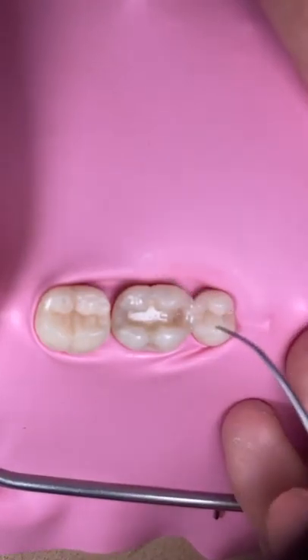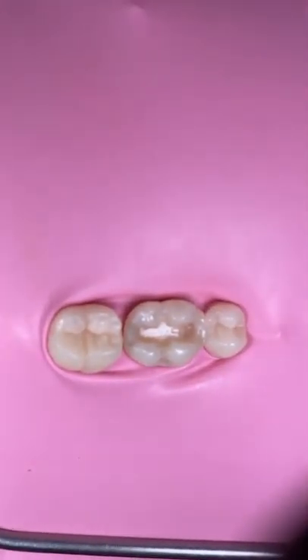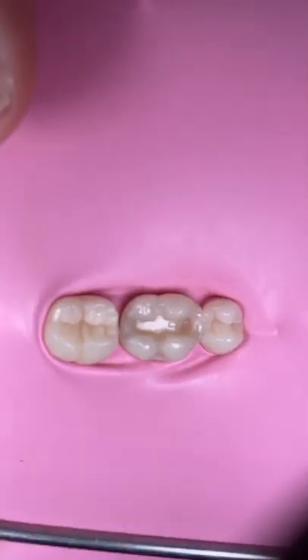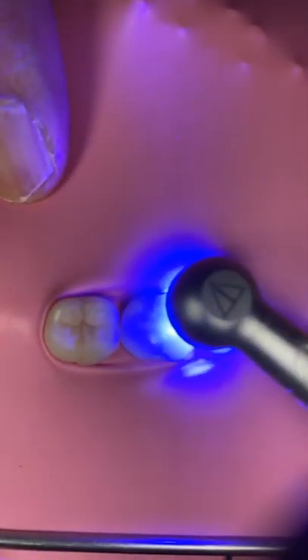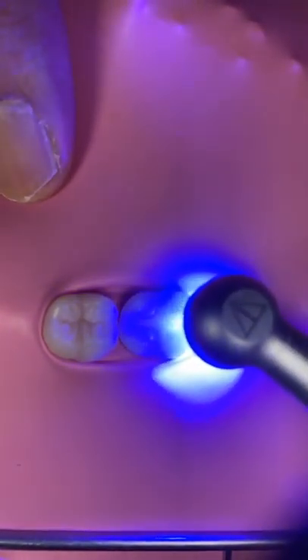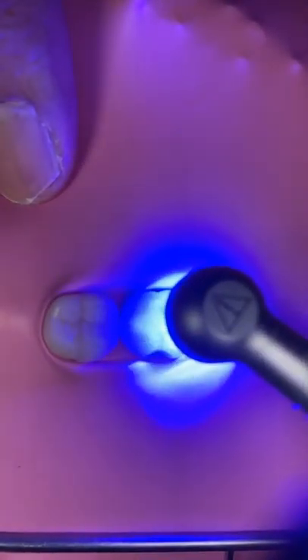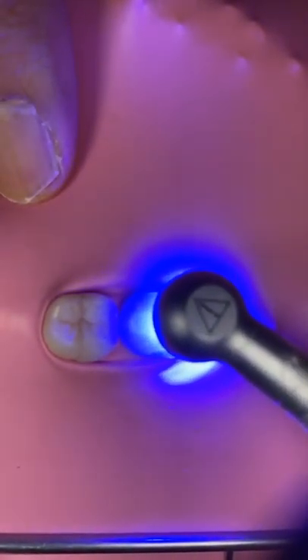This side you can easily deal with this excess by using the Soflex after the restoration is done. Okay, then cure. If you like to reduce the proximal with the Soflex now, you are allowed to do that, but for me, usually I will do carving first, and then I will do that later. Okay.